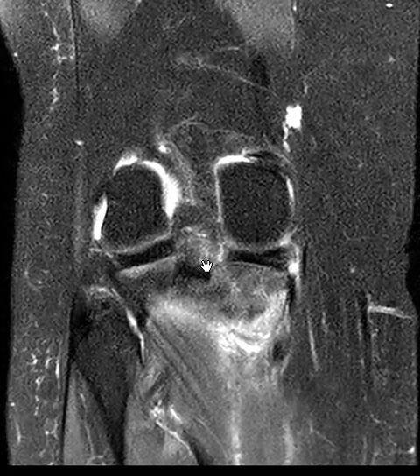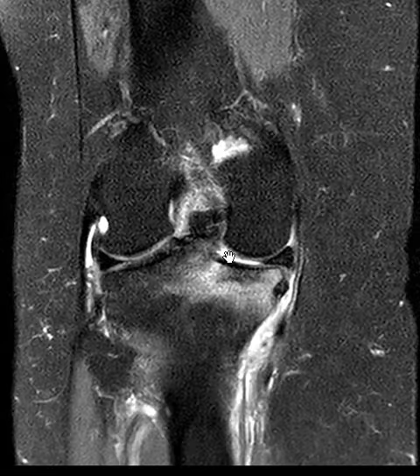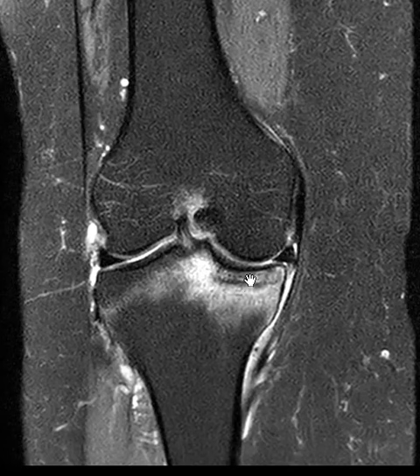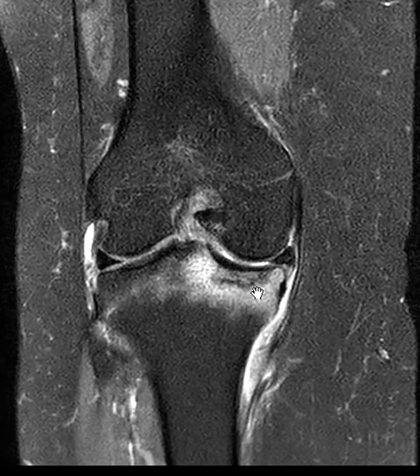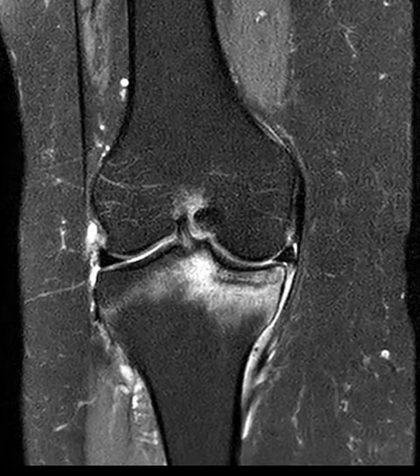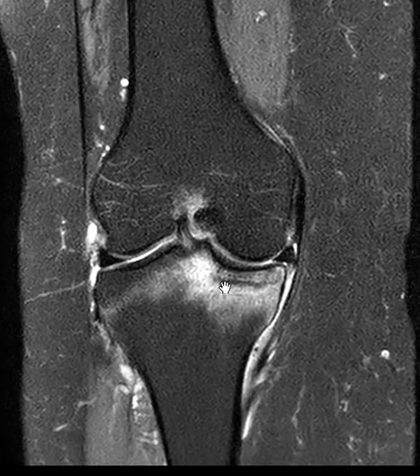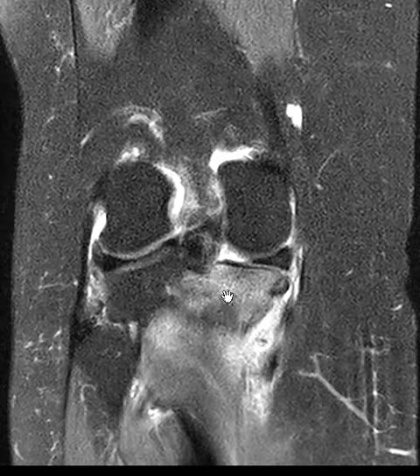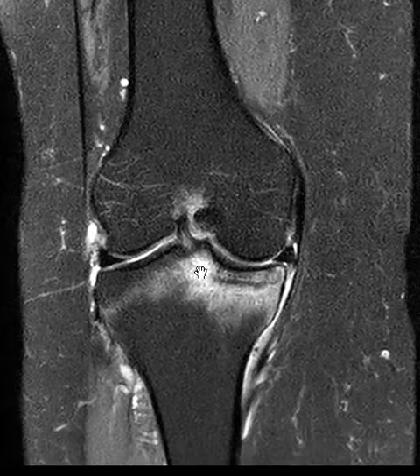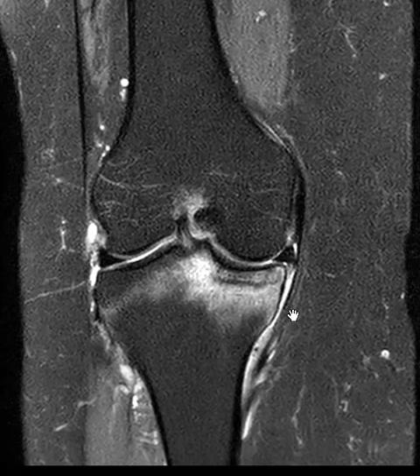This dark meniscus should come all the way down, but right here there's a gap — this is what we call a radial tear of the root. The root is torn and pulled away, resulting in loss of normal hoop stress, and so the axial loading puts a lot of pressure on the tibia. This is a stress fracture of the medial tibial plateau, and she may also have some bony demineralization accentuating this. This is a stress fracture of the medial tibial plateau associated with a tear of the medial meniscus root — and luckily we found it before it went on to collapse. Thank you very much.